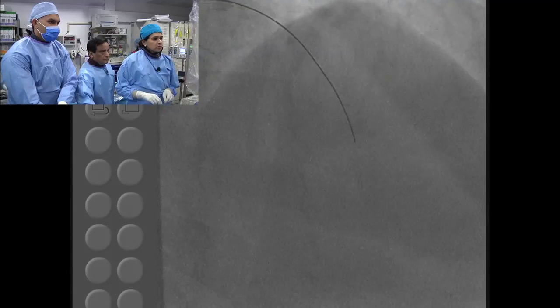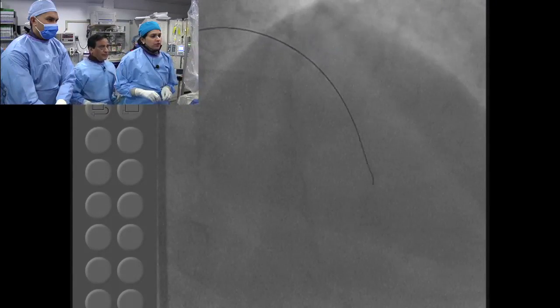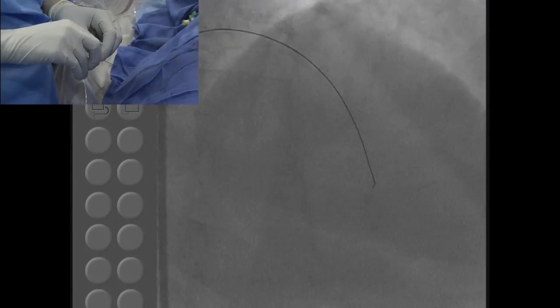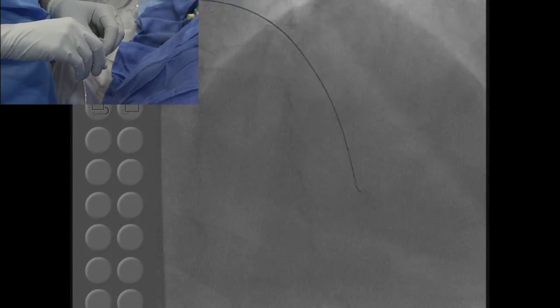And this is the Miracle 6? Yes. It looks like it went in the right direction. Right, and then the system. It was maybe a small septal there. ACT was 399, so they stopped the Angiomax for a few minutes. That was going to be my other question. Angiomax had been used here as the preferred agent.